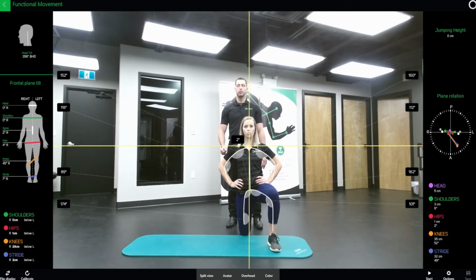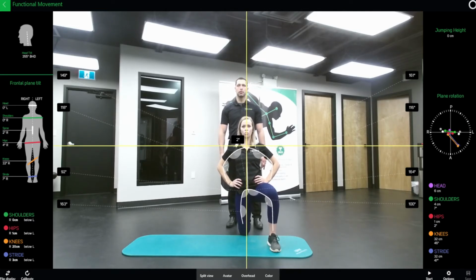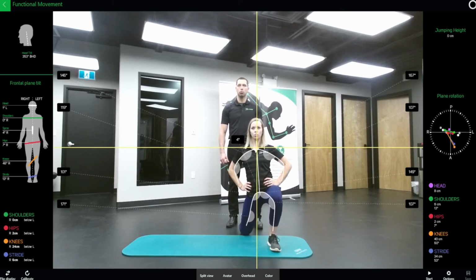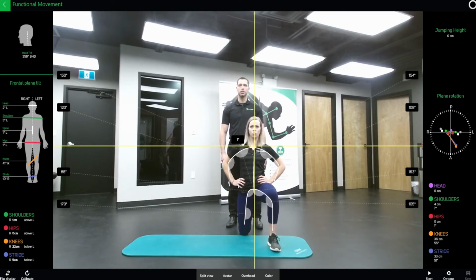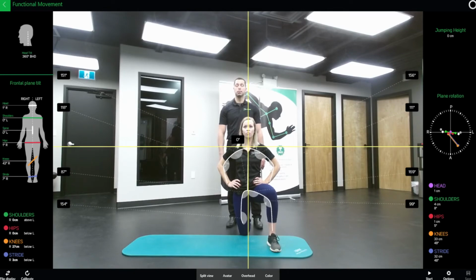Let's go into shift to the right, Maggie. Try to keep shoulders square, and to the left. You can see here that she has much more mobility shifting to the left on this leg than she does going to the right. That's presented with Kinetisense on the right-hand side of the screen from that transverse view. It's a great advantage to have the bird's eye view to show how much shifting is occurring. We would obviously do the same assessment with the opposite hip.